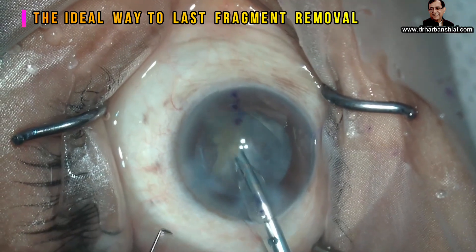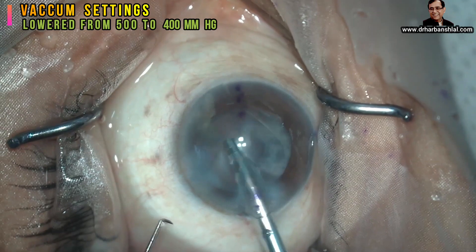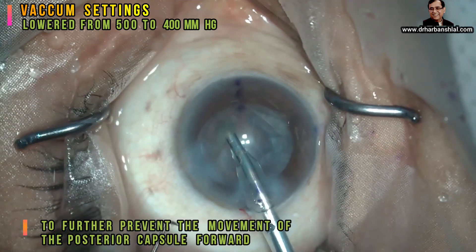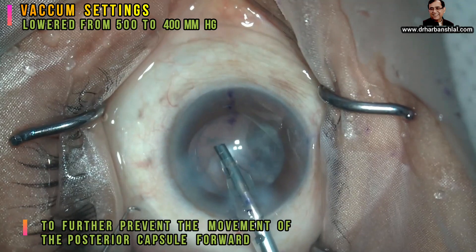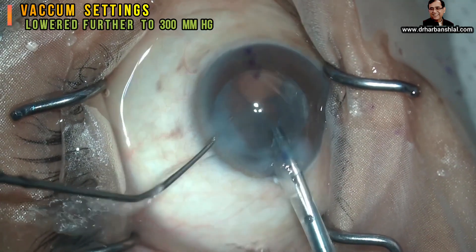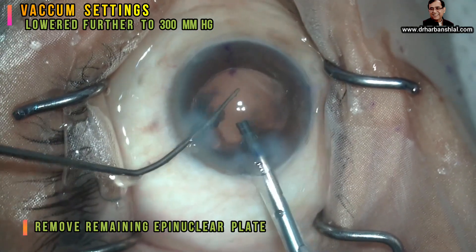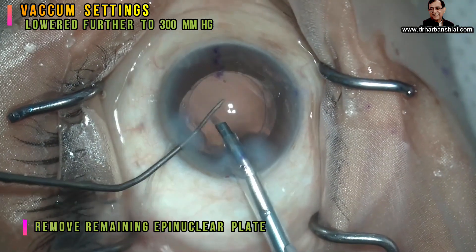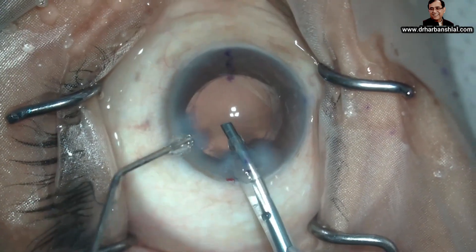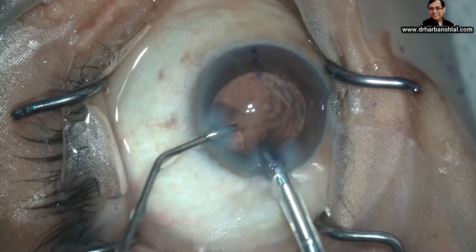The vacuum settings have been lowered from 500 mmHg to 400 mmHg to further prevent the posterior capsule from moving forward. Lower the vacuum settings even further to 300 mmHg. Now remove the remaining epinuclear plate with a rounded repositor. You can then remove the phaco tip after injecting viscoelastic.